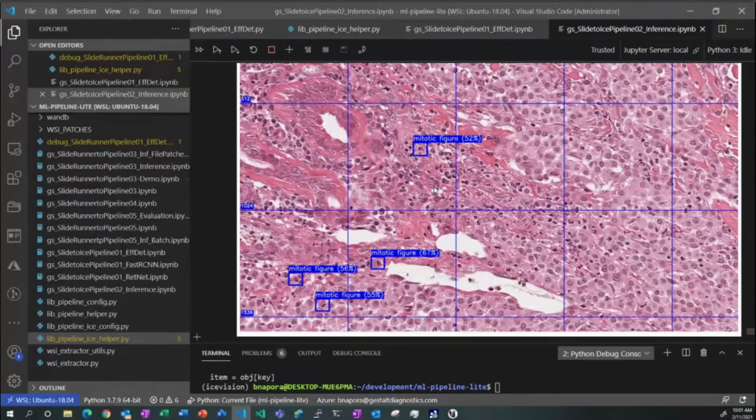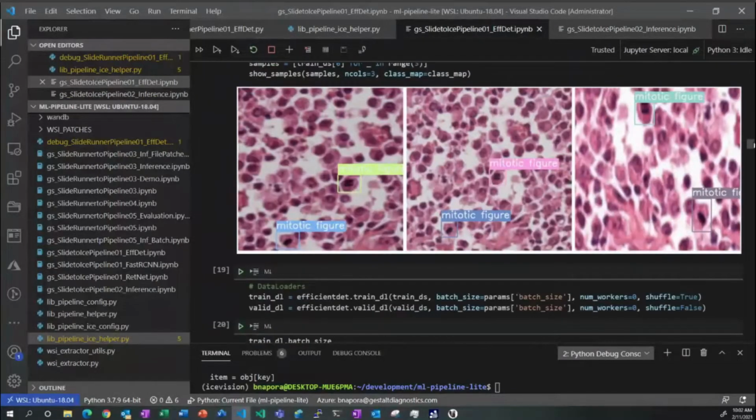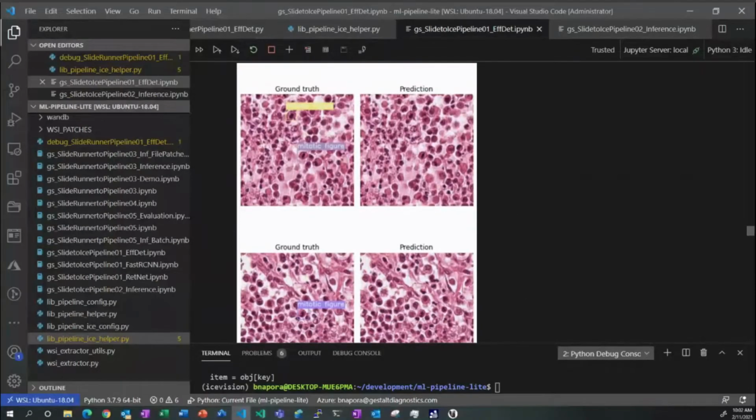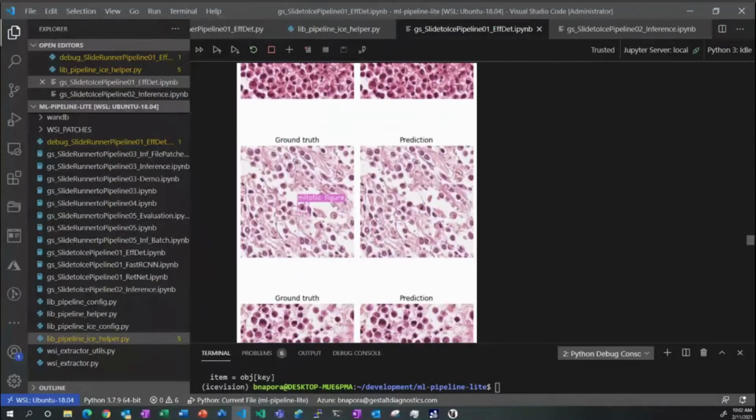And this is for the model that you just used 50, as you're saying? Oh no, this isn't for that. This is that model that I got about 86% map score on. I see. Very nice. That model with 50, it did not do very well at all. I can show you. Here's ground truth. Here's prediction. It's not finding much stuff.